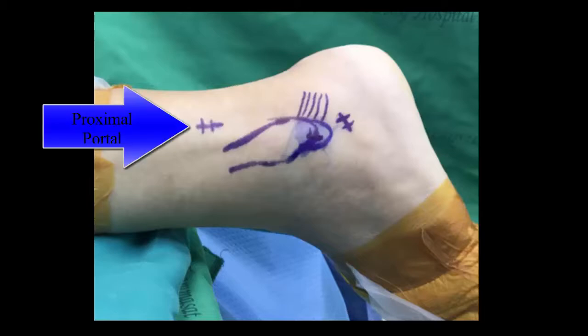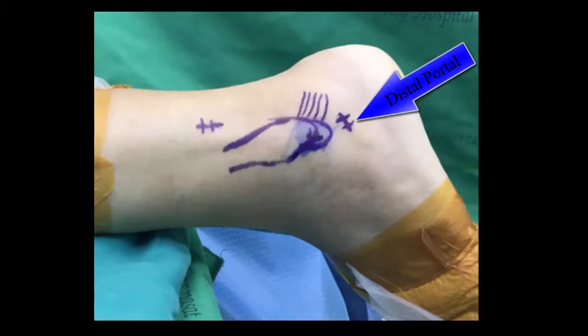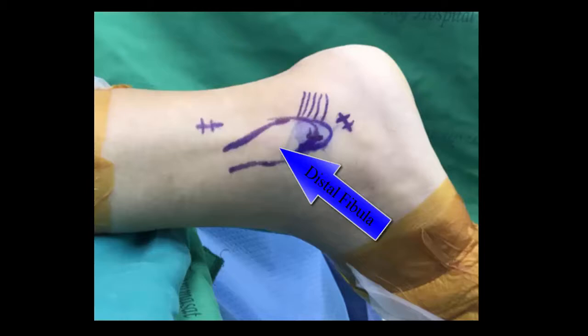The proximal incision was made 6 cm proximal and 1 cm posterior to the posteriormost aspect of the fibula. On the basis of the proximal portal tendoscopic visualization, the distal portal was made 5 to 10 mm distal and 3 to 5 mm posterior to the tip of the fibula. The proximal viewing portal and the distal working portal may be changed according to the location of the pathology.